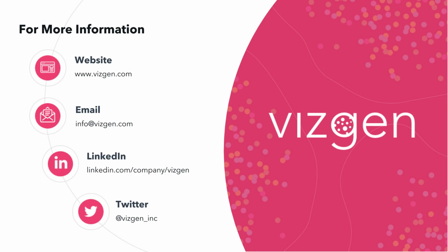Thank you. Next question. With the neuroblastoma tissues, we see high fluorescence. How do you take care of the autofluorescence? Yeah, I think this is a great question and really relates to the previous background question asked before. So indeed, in brain, lipofuscin and such is one of the major concerns and causes a lot of background. And the two steps mentioned, the autofluorescence quenching and clearing, in general, can help remove all the background. And if you're interested in seeing how this performs, you can go to our website and download our tech note. We do have a section on how to address the autofluorescence background. Thank you.